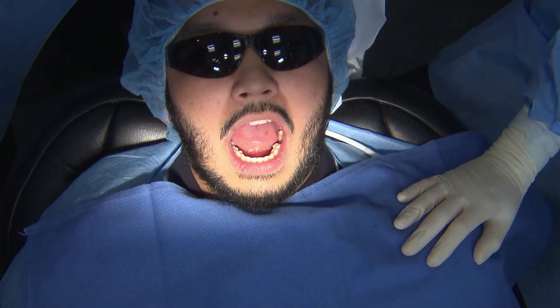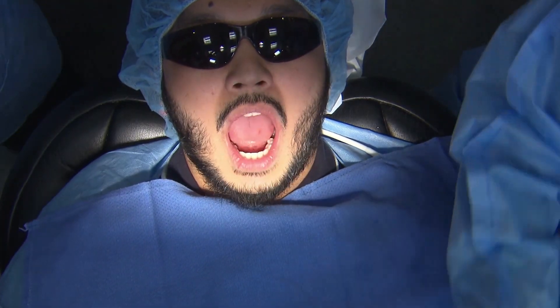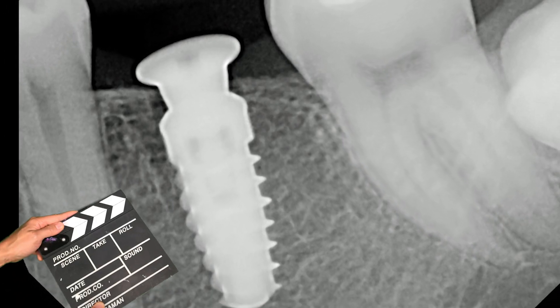Just to make sure all is good. You can see the implant is placed kind of in a 2D spatial view — we can see it's placed right where we want it to be.